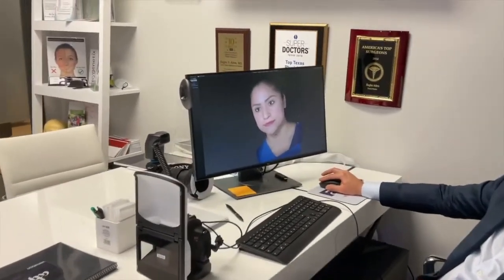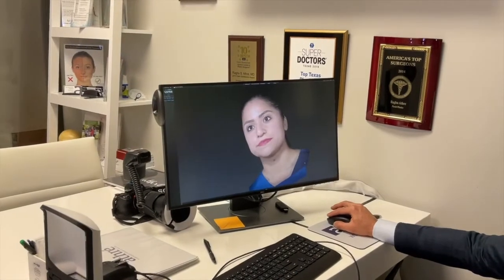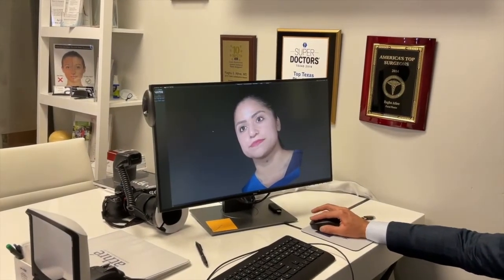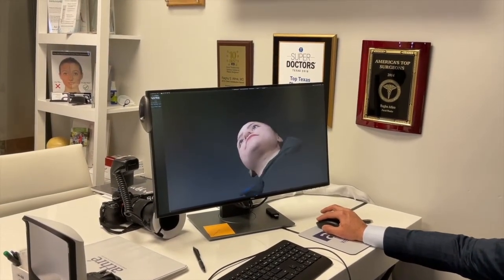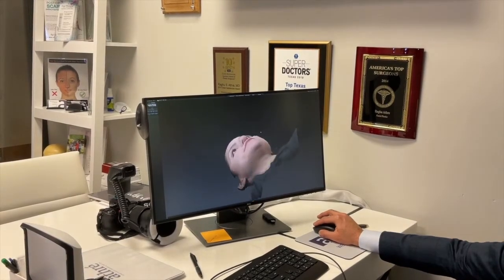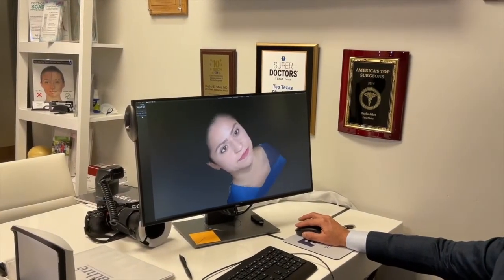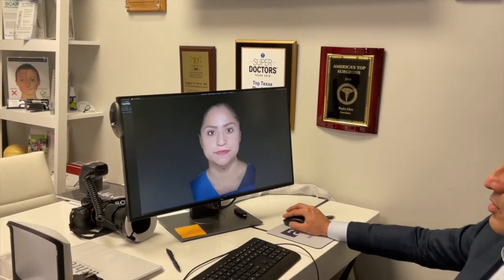I'm going to bring the camera over so you can actually see what the 3D model looks like. This is a 3D photograph we shot of Deb up front today — you can rotate it, see what the nostrils look like, the basal view. This allows us to image the nose in three dimensions.